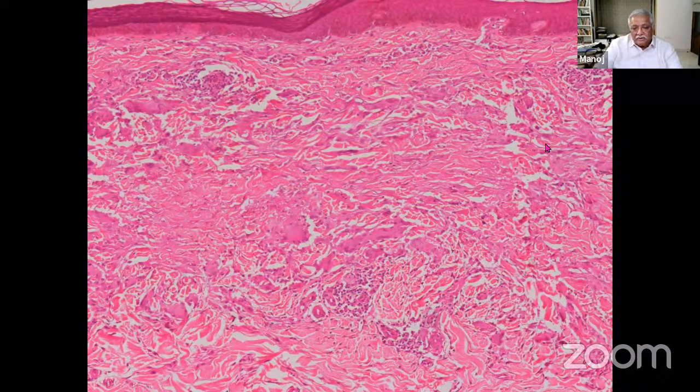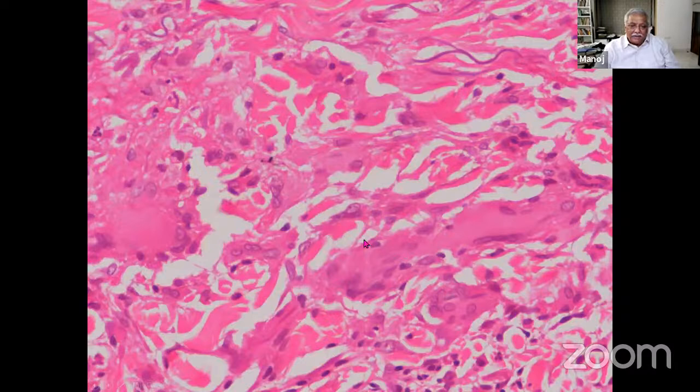There is dermis. There is a granuloma here. There is a giant cell here. There is a giant cell here, right? And these giant cells are actually not present in the classic tuberculoid granuloma appearance. They are going in between the collagen bundles. This is known as an interstitial granuloma, right? And this is in reaction to the dermal degeneration. Make out here, the dermis is degenerating and the granuloma is forming in reaction to that.